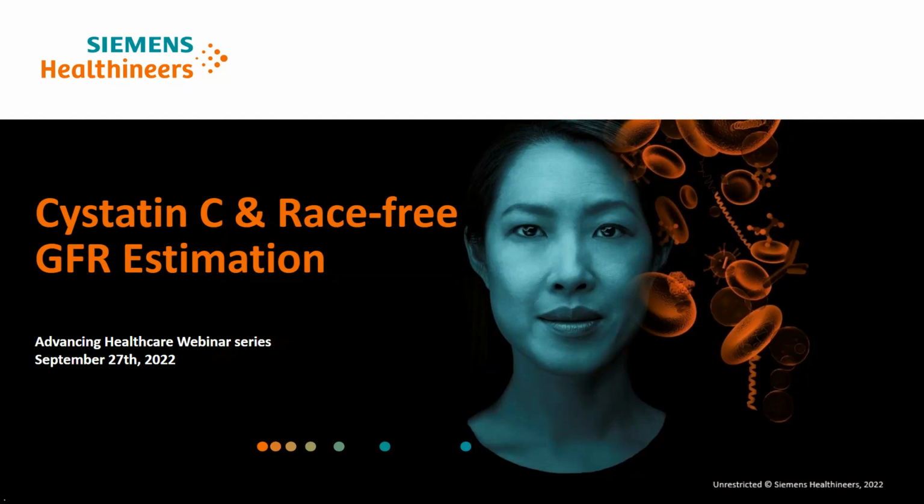Yeah, that's a great question as to how to implement this and which equations to report. I think in the future, in an ideal situation, we would actually report a trio of estimates: a creatinine-based estimate, a Cystatin C alone-based estimate, and then the combined estimate. And why I think having all three is important, Dr. Potok alluded to this earlier.